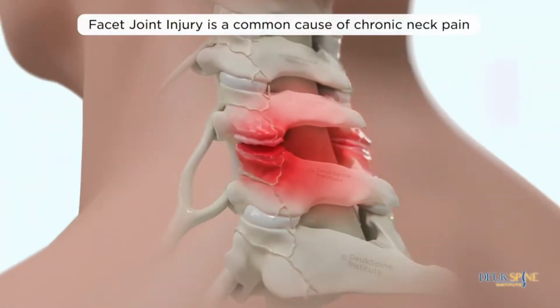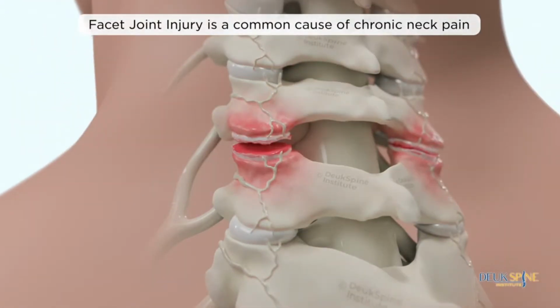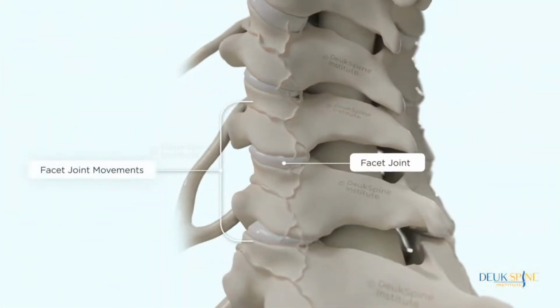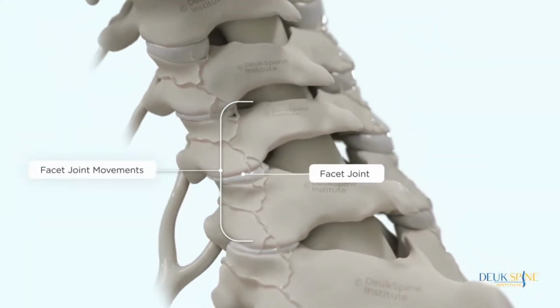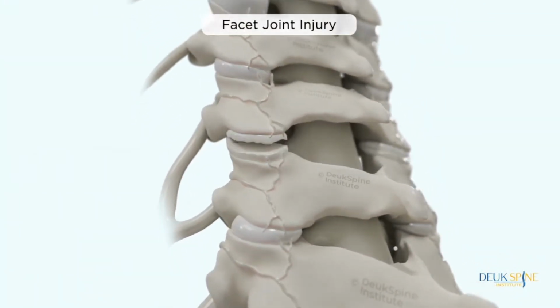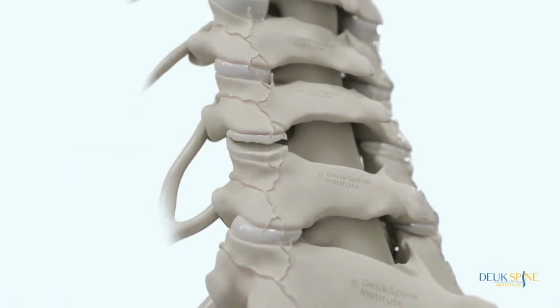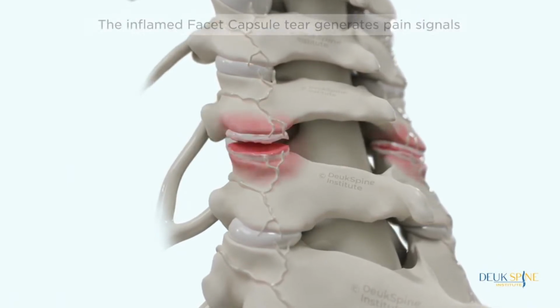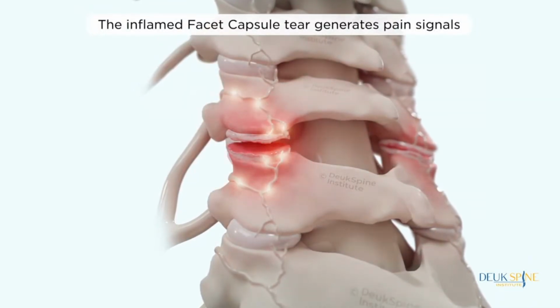Facet joint injury is a common cause of chronic neck pain. The inflamed facet capsule tear generates pain signals.